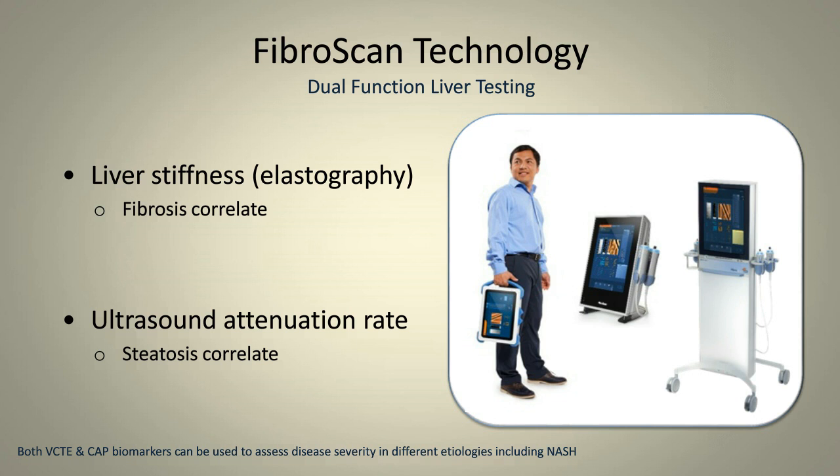Now, there are really three different flavors of this scanner that you can use. Kind of started with the 502 Touch, this stand-up unit, and then it kind of went to the one that looks like R2D2, and then there's the portable, what we call the 430 Mini, which, as you can see, is about the size of a laptop, and you can easily carry it around with you.